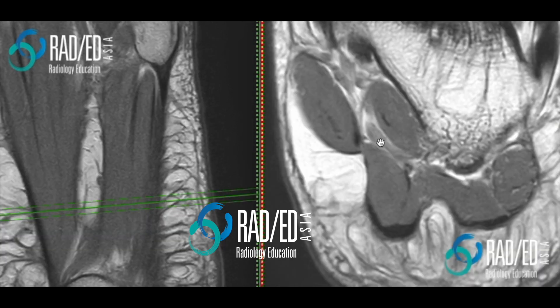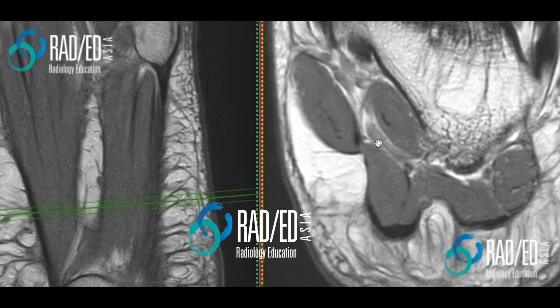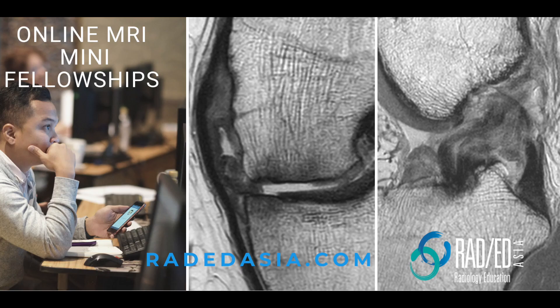The medial band is not something you really need to worry too much about — it's a pretty thin band and you don't tend to see any abnormalities of it. It lies superficial to abductor hallucis, on the superficial margin of that muscle.